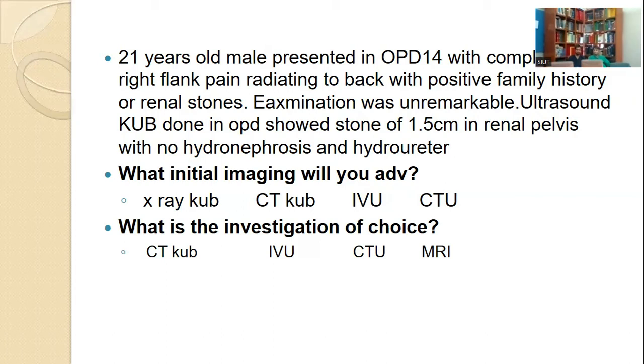Okay, the Hounsfield unit is 400. So ESWL, okay, you have presented the case. Anyone? Any senior? No, we'll come to the seniors later. The stone density when you perform the CT KUB was 300 or 400. We are not talking about thousands, just 300 to 400. So you go for CT KUB to check the Hounsfield unit.